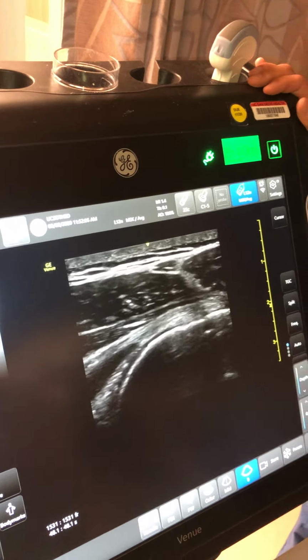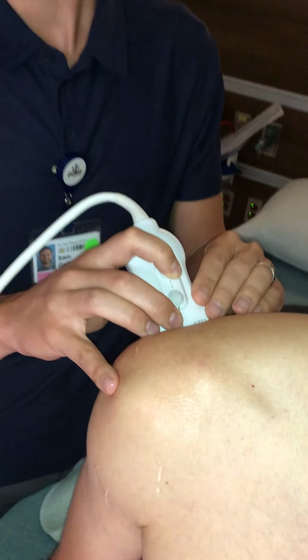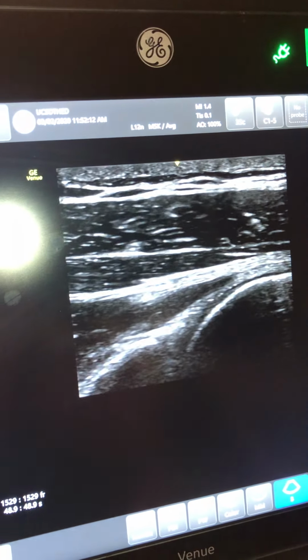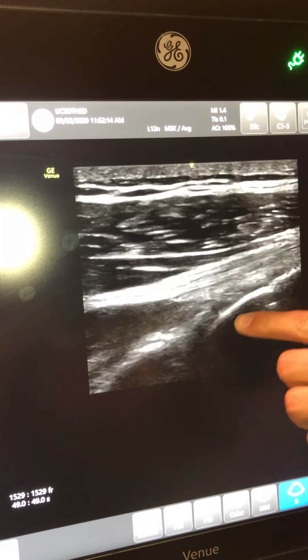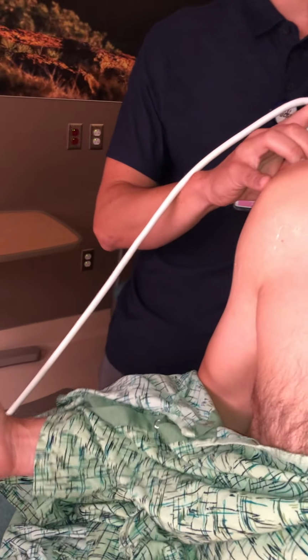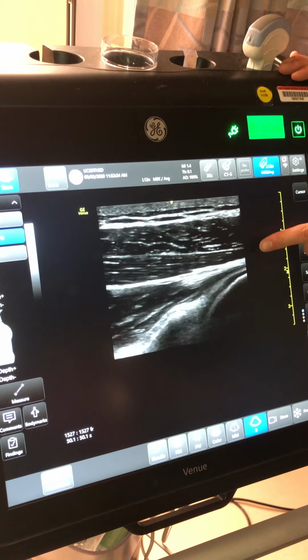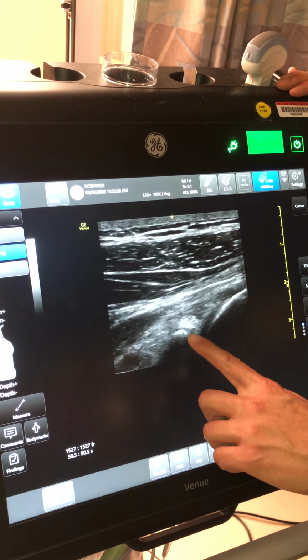And then we come back around, so tendon, and then here's the view where we get the posterior view of the joint line as well. So now we're looking at the humeral head on the right. He can bring his arm into internal external rotation, and you can see that moving. Do that one more time, Charles. And then you see the glenoid there on the left.